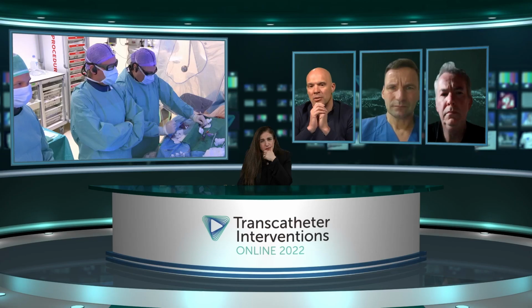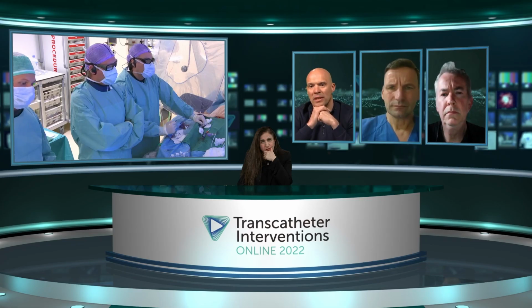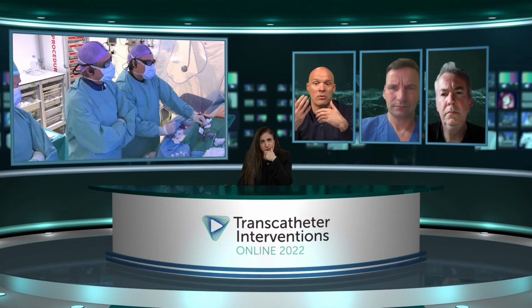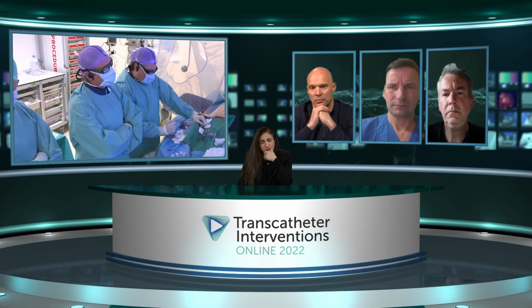So I would put a wire in the circumflex, do an IVUS, and then have a good assessment of that left main. At the same time, I would also be interested in making a very good spider view in order to see whether there is a proximal cap in that ostium of the LAD that might help in the decision whether or not you want to at least attempt an antegrade approach.